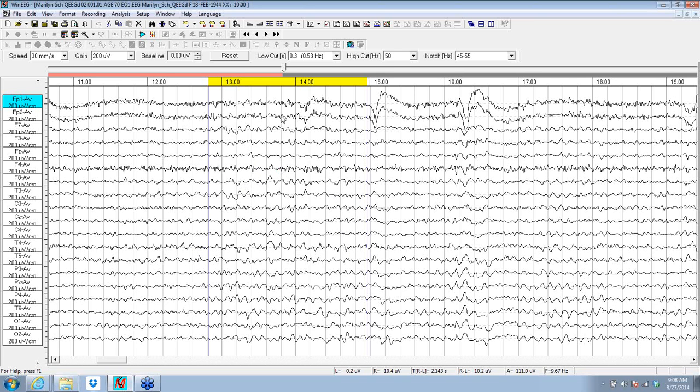And when we look at this, it's a fifth of a second between the pale lines and 1 second between the dark lines. So if we look at it in this fifth of a second where it happens, we see a wave and a half. So this would be about an 8 hertz rhythm, but there's some of it that doesn't quite hit the next peak, so it might be just a little below 8 hertz. So we can expect, as we look in the raw EEG, kind of a slow edge of alpha in the temporal lobes, and this is at F8, T4, and a little bit at T6, you can see.